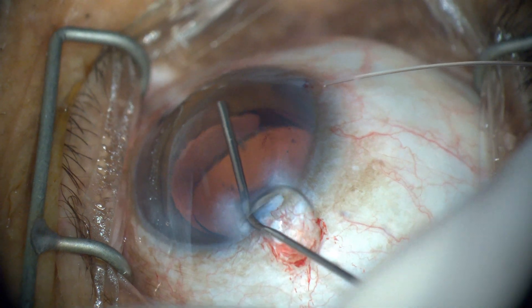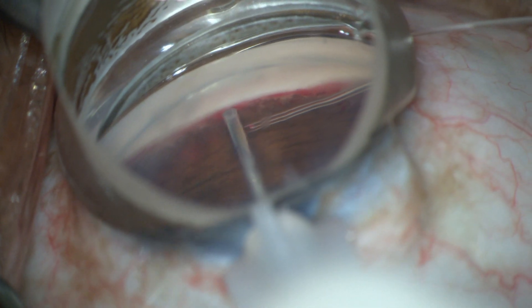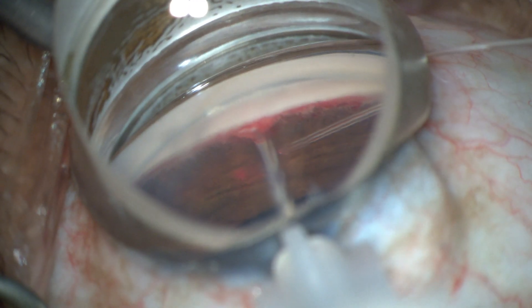The head and microscope are tilted into a gonioscopic position. A 27-gauge needle bevel-up is used to create a 1-2 mm goniotomy and the posterior lip of trabecular meshwork depressed.